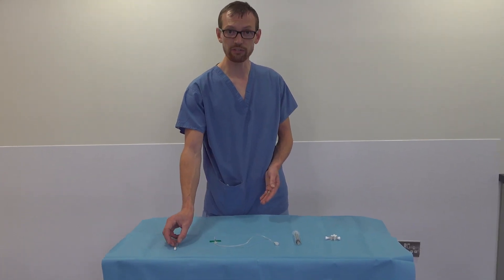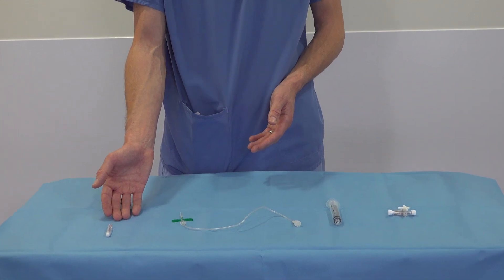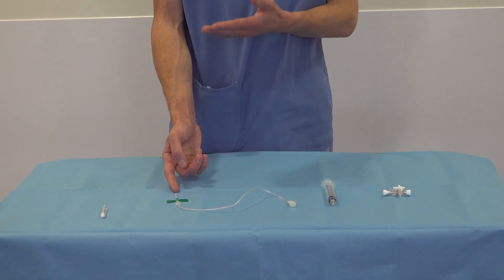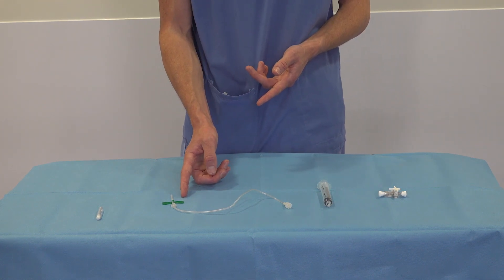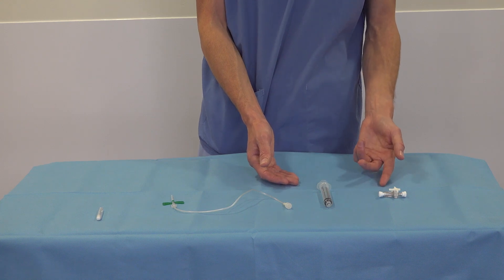We have our cleaning fluid, which should be appropriate for the gestation of the baby. We have our butterfly — we have a green butterfly because we have a term baby today, but in a preterm baby you'll probably use a blue butterfly, which is smaller. A 10ml syringe and a 3-way tap.